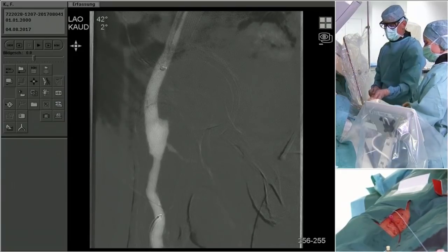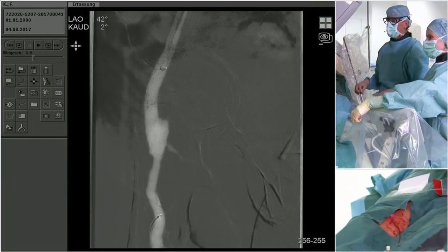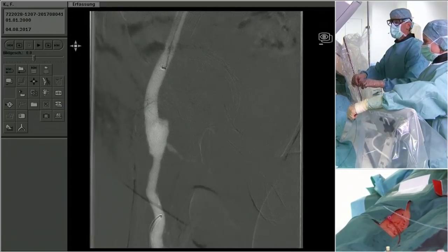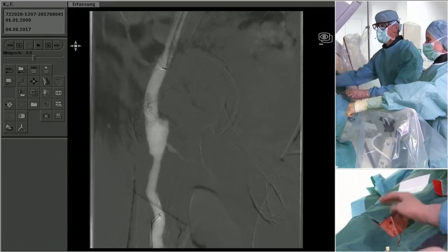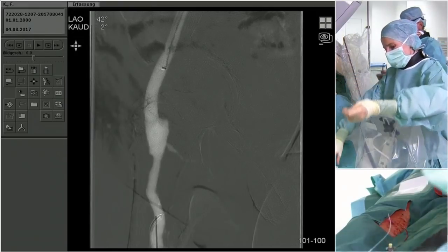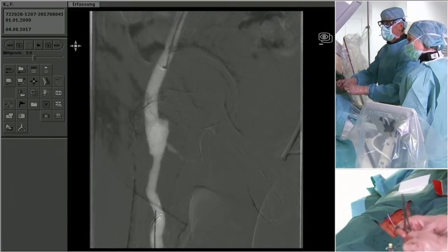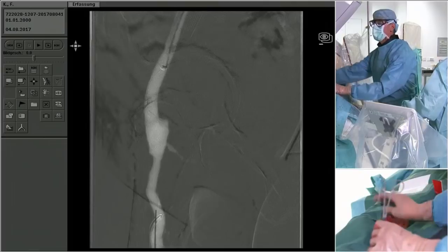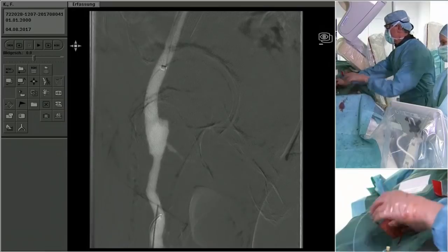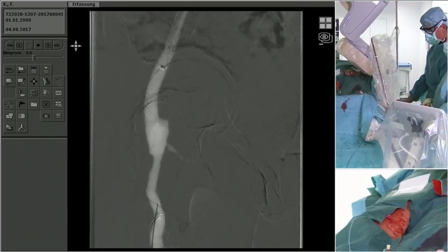You can, of course, use now a little bit the back end of the Terumo to break maybe upwards. It may give you the wrong direction. The Brockenbrough needle is in this regard better, but for a start, of course, we will start this here. We take a clamp here around the wire and the catheter, leave the wire a little bit outside and try to poke a little bit in. But you see here, it's not really giving me a good direction, and in fact, also not giving me the strength to break through here.